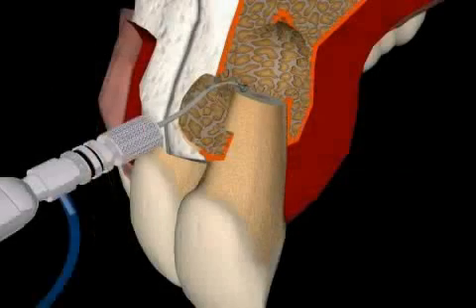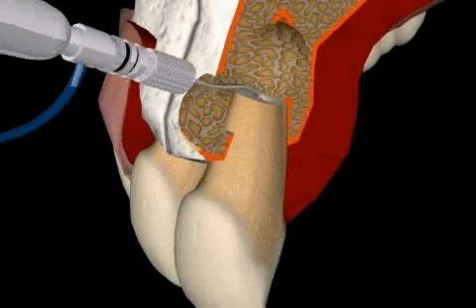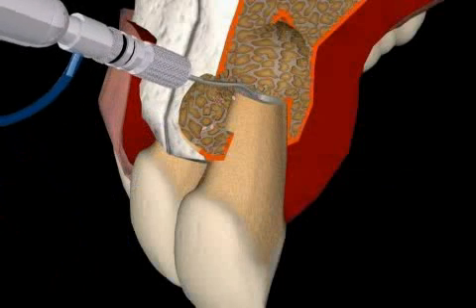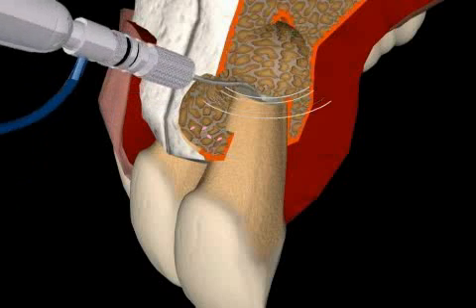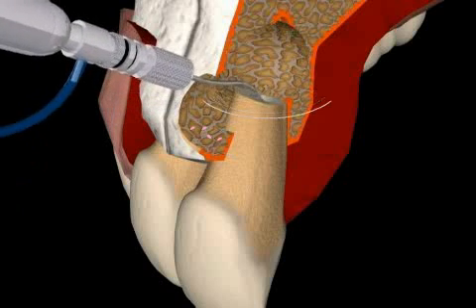Now, the root is conically refurbished from below using special instruments. The pink parts are remnants of the old root canal filling. Root refurbishment is done with ultrasound instruments and water is used for cooling.